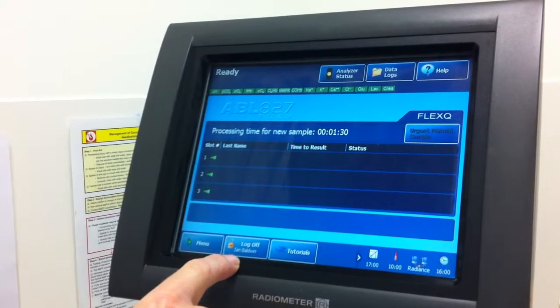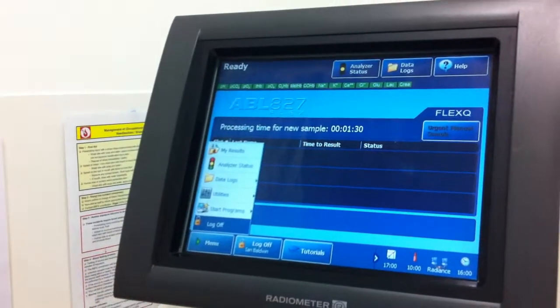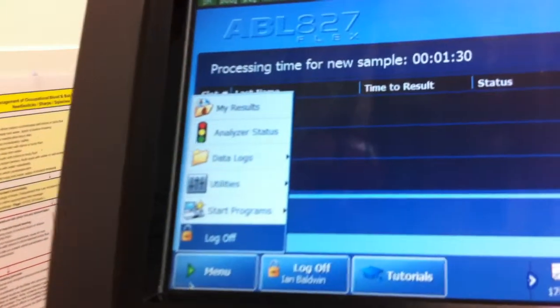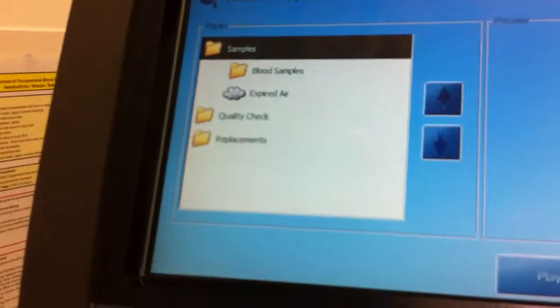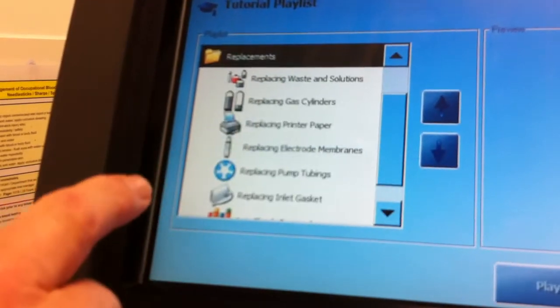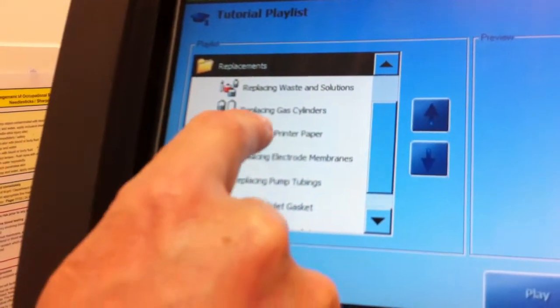I'm logged on, so my name appears down here. There's a menu here we could look at, and that brings up a number of options, including showing the analyzer status, results, and other things. I'll just show you this last one here called the tutorials. The one we often show people is replacements down the bottom, and in particular how to replace the printer paper.